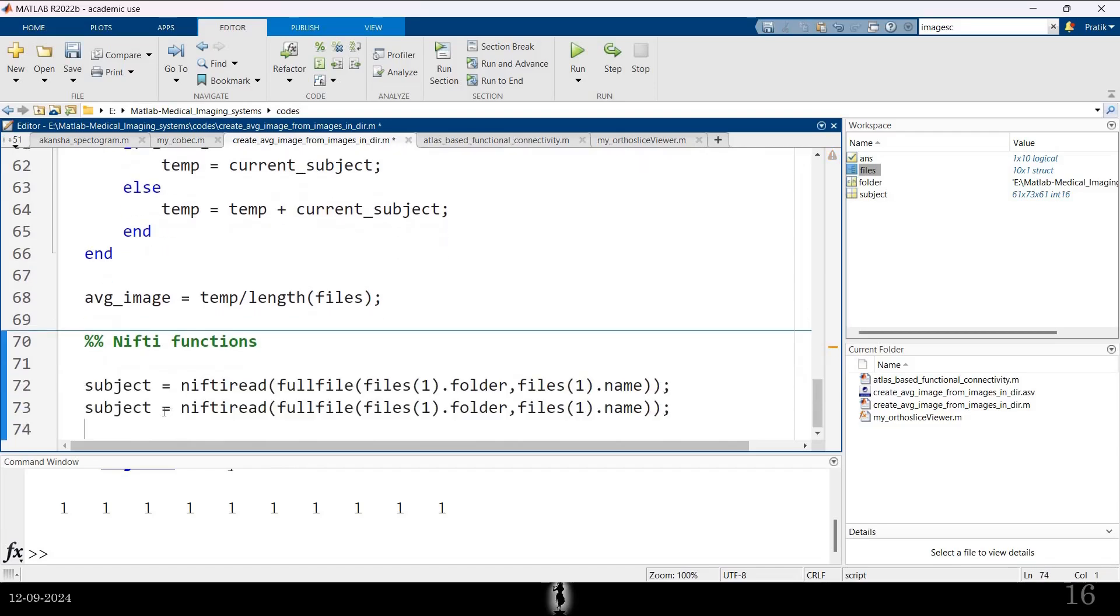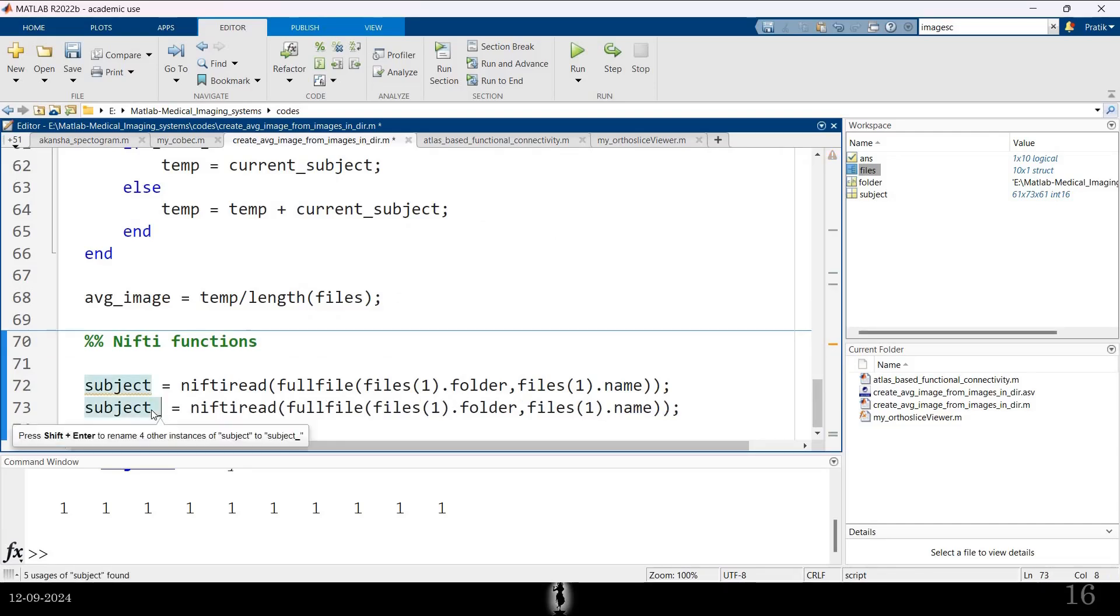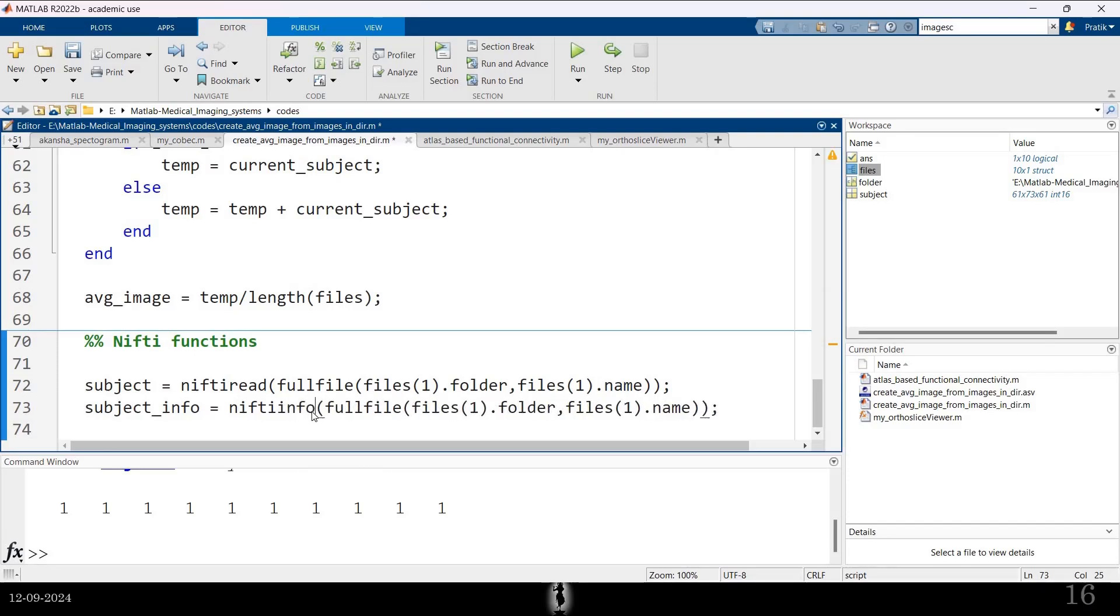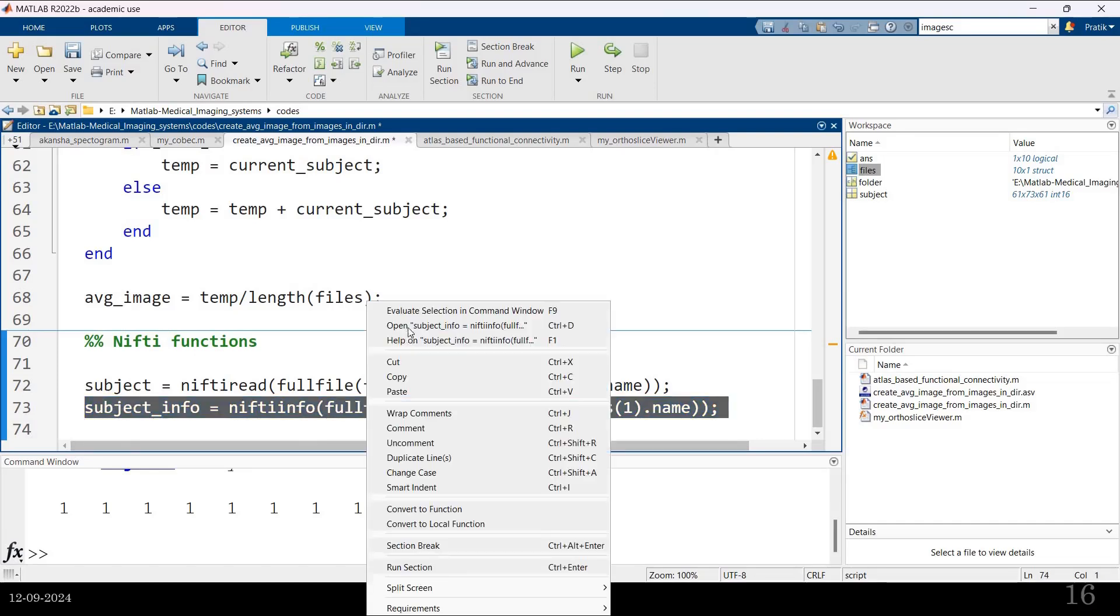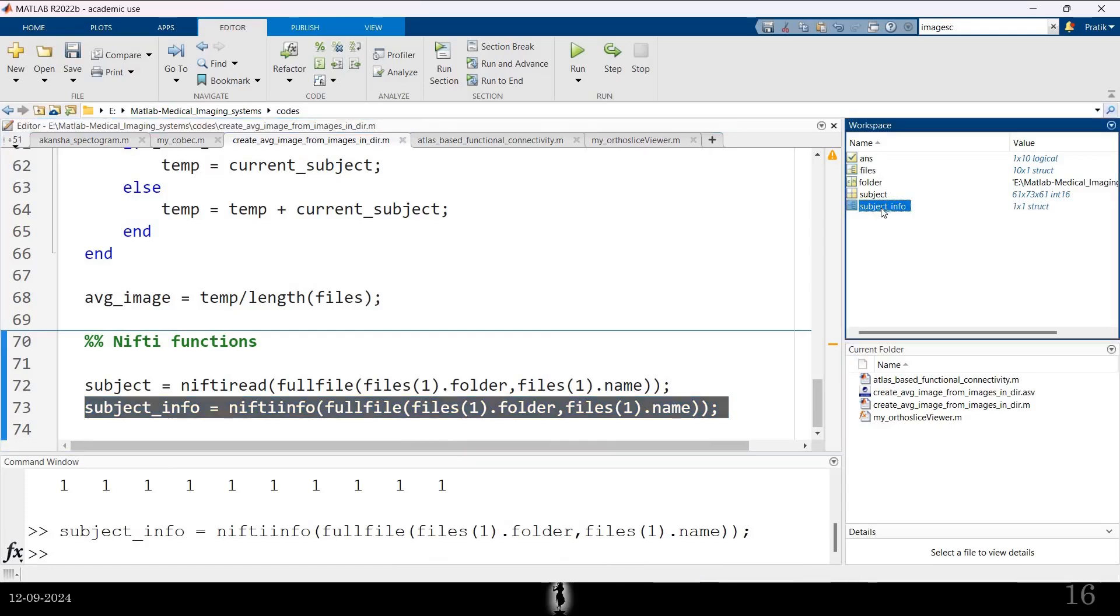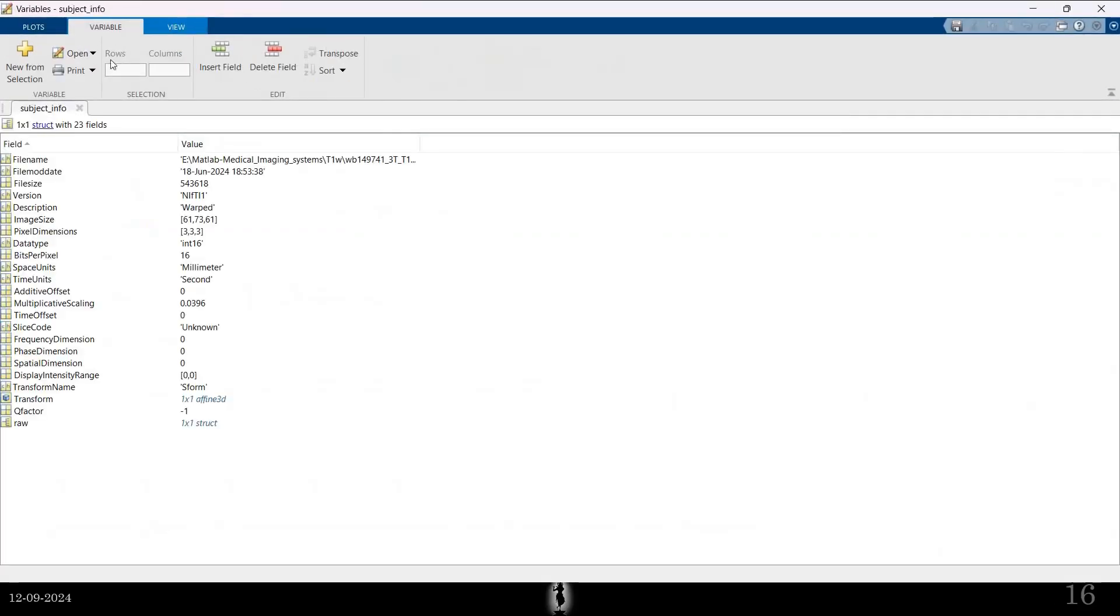You can also see the header using what is called as Nifty info. Nifty info will give you the header. Let me just execute that. Okay. Again, that's a structure variable.